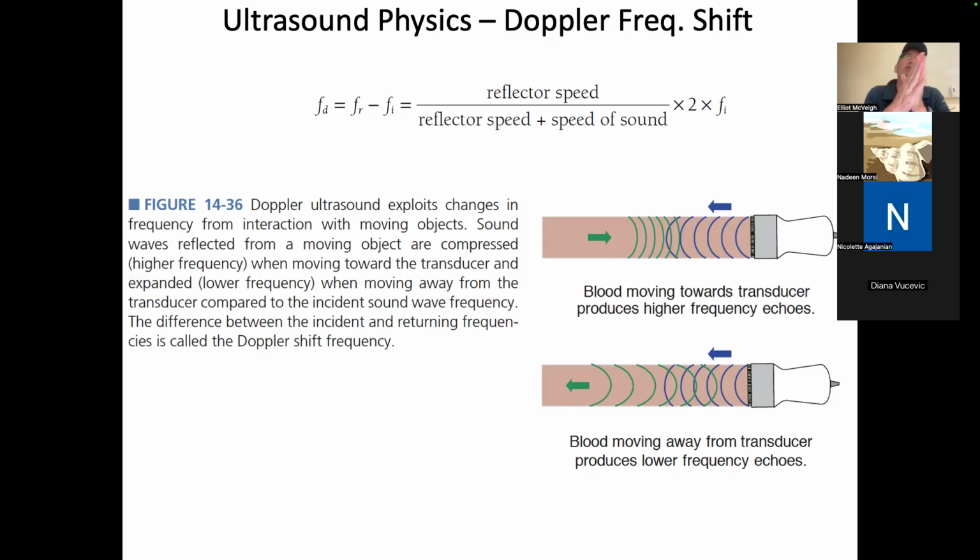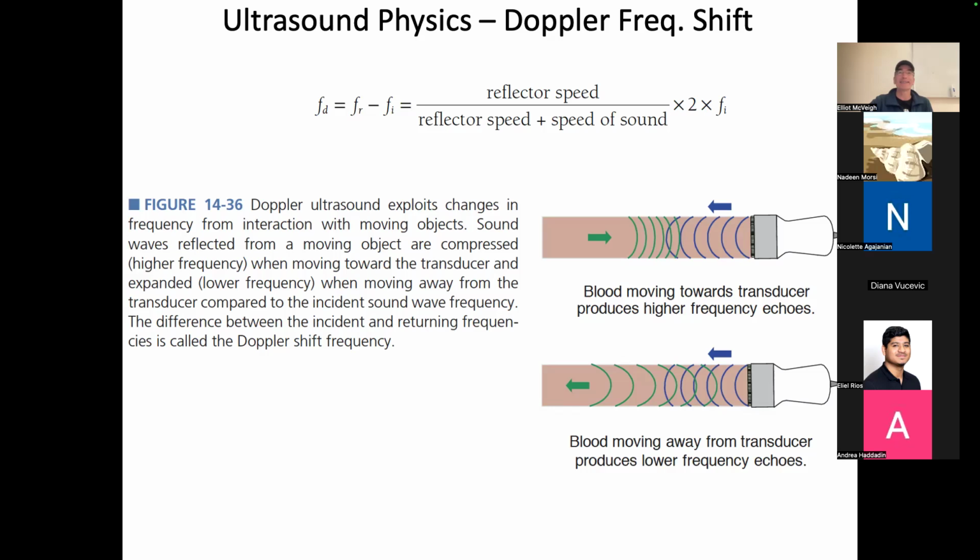It can also give you estimates of peak velocities in physiological places that have been stenosed or made the orifice itself has been made smaller. Say, for example, in the aorta, if it's pinched down, or in the aortic valve, it might be too small, the orifice might be too small, and that will cause a very high velocity jet of blood. And so you'll be able to see that and actually quantify the severity. So getting a quantitative estimate of what the blood velocity is helpful.